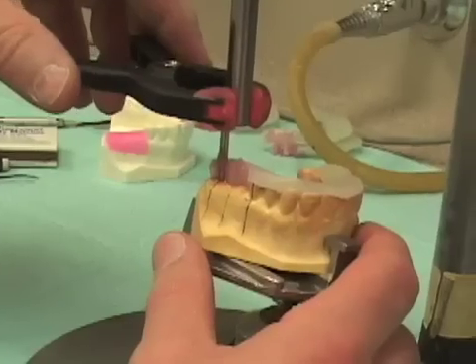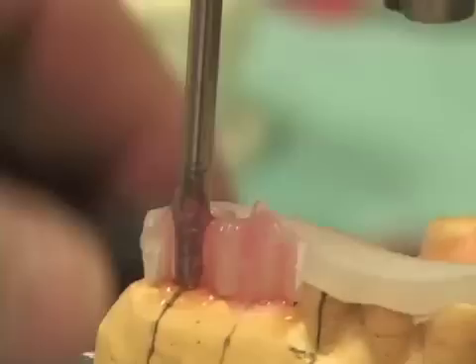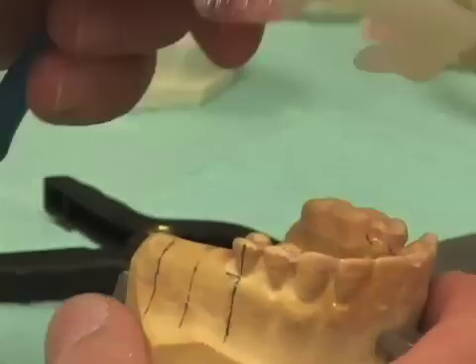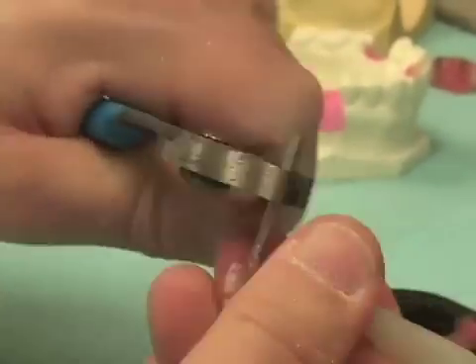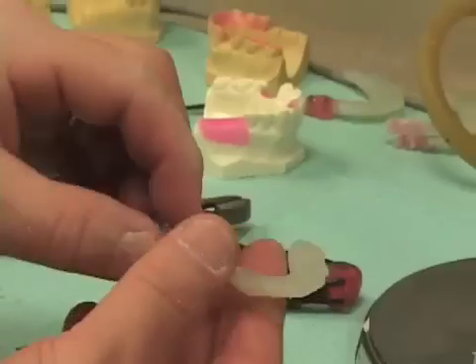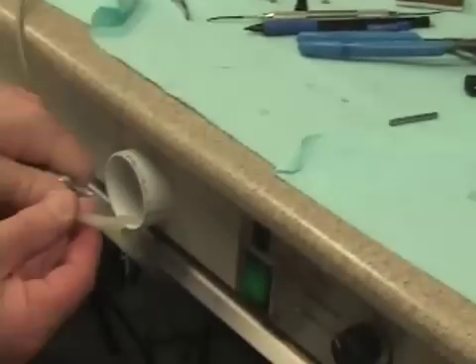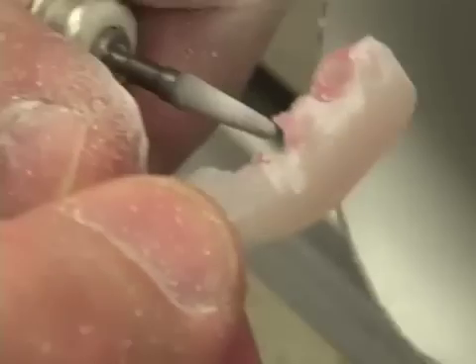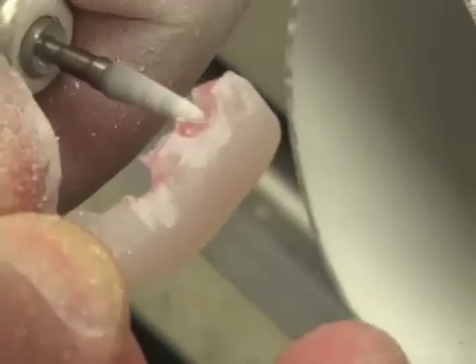We've now completed the curing of the triad gel for this second implant location. We're free to take our plier, remove our surgical guide from the cast, grasp the drill blank with the plier, twist first, and then lift. I'll now go near the evacuation port and trim the excess at the occlusal. With these larger drill blanks, we've already broken through the buccal aspect, so we can fairly quickly trim the excess.